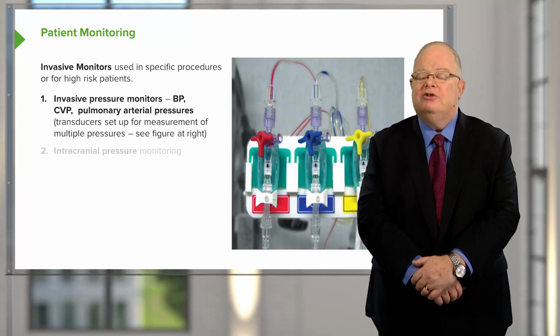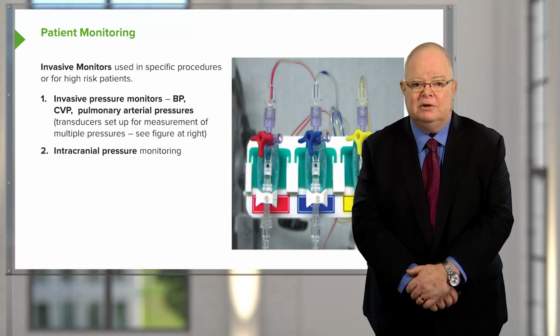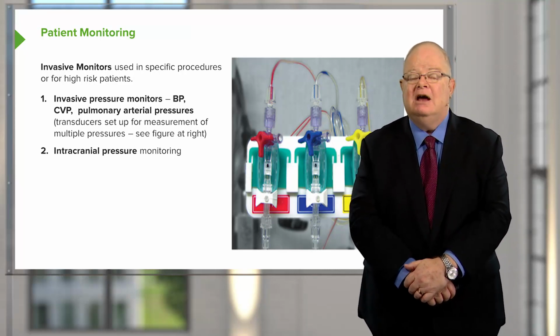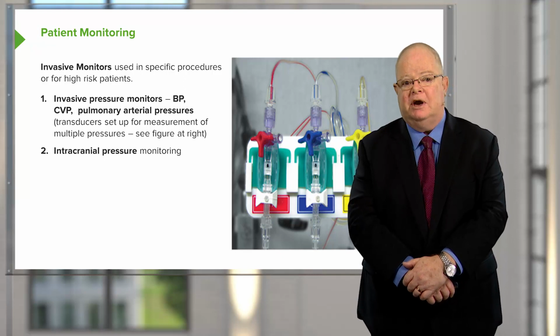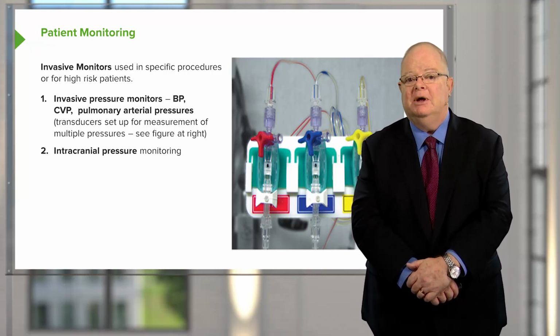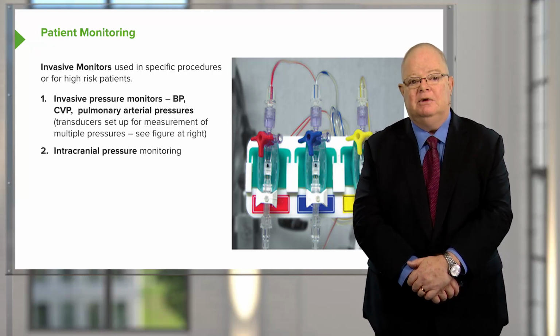Patients who have intracranial hemorrhages or trauma to their head and have bleeding into their skull can have monitors placed that measure their intracranial pressure. So that kind of monitor is placed by a neurosurgeon, but we're the ones who hook it up and we often monitor it.